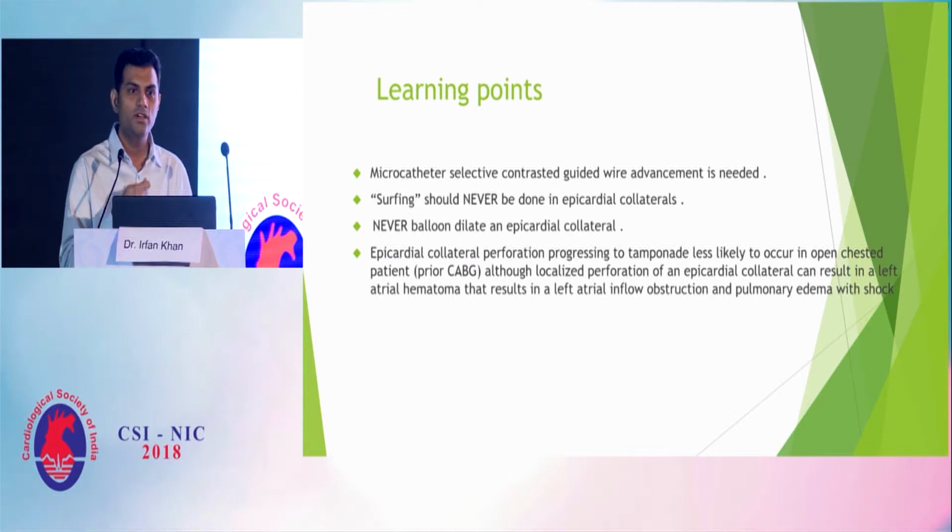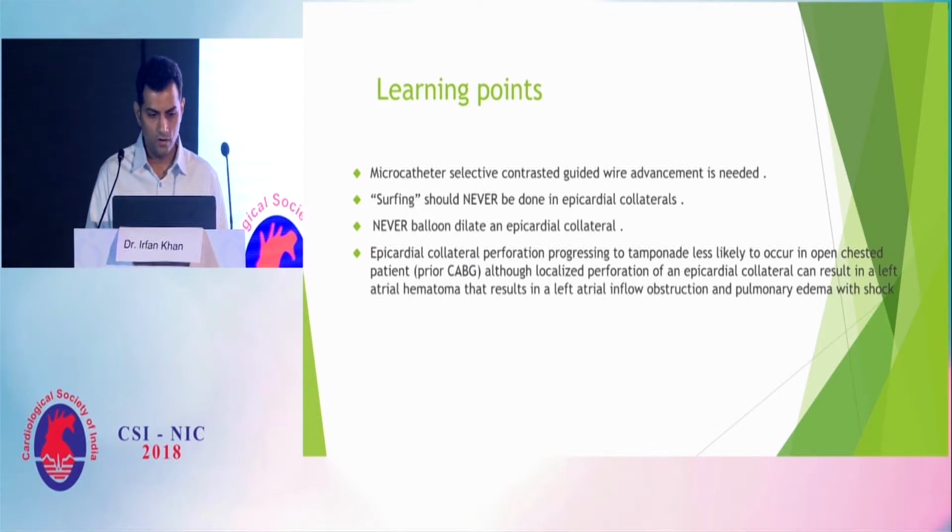Surfing means that you find the path of least resistance in septal collaterals. But that should never be done in epicardial collaterals, because if you're trying to find the path of least resistance, you might perforate it. Never balloon dilate an epicardial collateral. Post-CABG patients are less likely to go into tamponade because they are open chested, but even then they can have left atrial hematomas which can lead to inflow obstruction, pulmonary edema and shock.